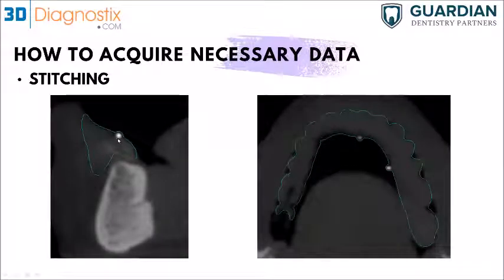So we use those markers as reference to match them from the patient's denture to the scan. And this is also another cut or another view where you can see the bulging of the markers here and the radiopacity of those markers as well.